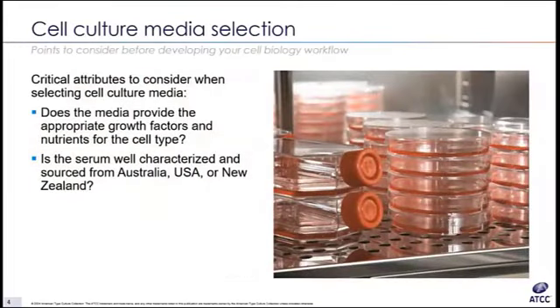So let's get started. Selection of cell culture reagents is often the first step in designing a new cell biology workflow. Whether you are in early discovery or ready to scale up your workflows, selection of cell culture media is critical for the success of your project. When making this important choice, there are several points to consider.